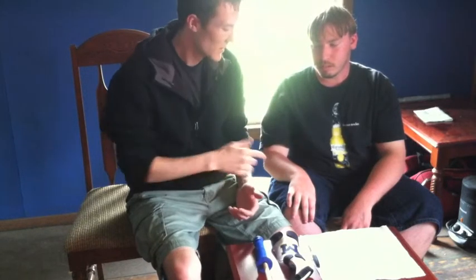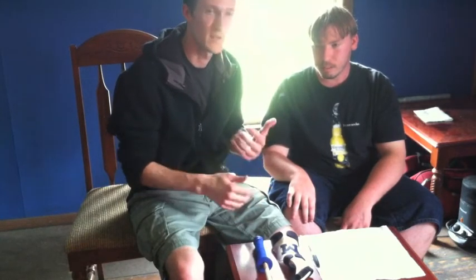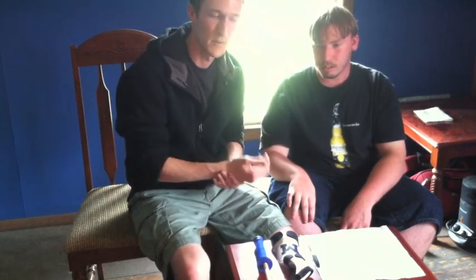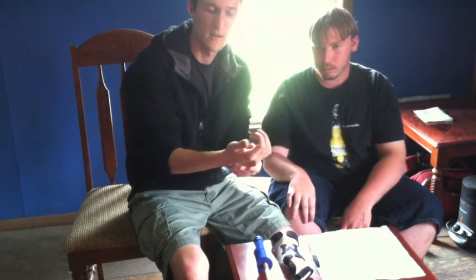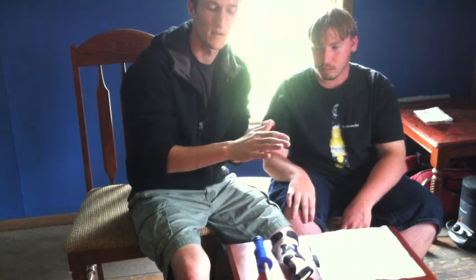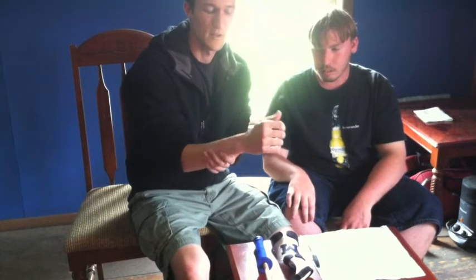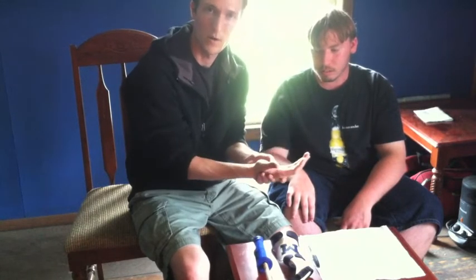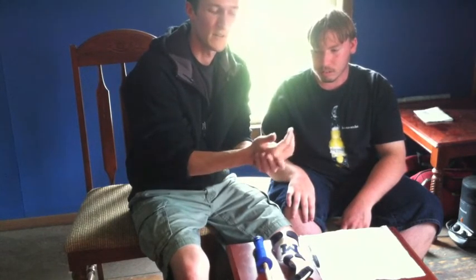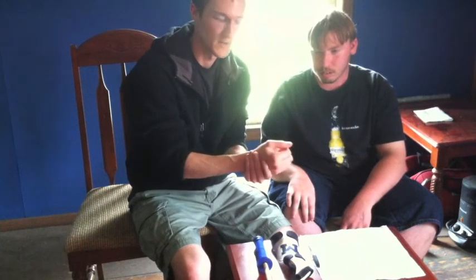And I'm sure, Nick, that's something that you struggle with a little bit more, just because of the anatomical aspect of the wrist. But still, the wrist is going to be in more of a neutral position, and also with the fingers being able to grasp the drumstick. So really the focus here is to help neutralize the wrist, and also to support the palmar arch, and by bringing the fingers out a little bit or extending them, he can grip the drumstick better.